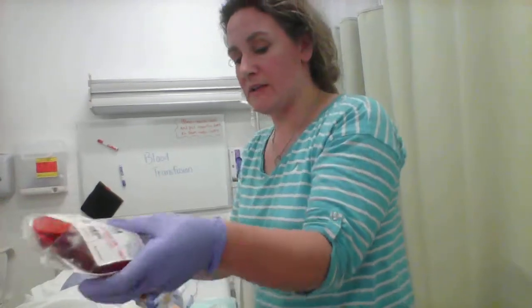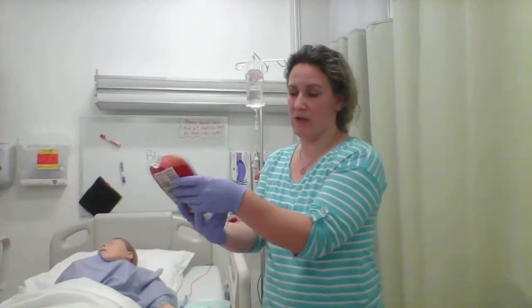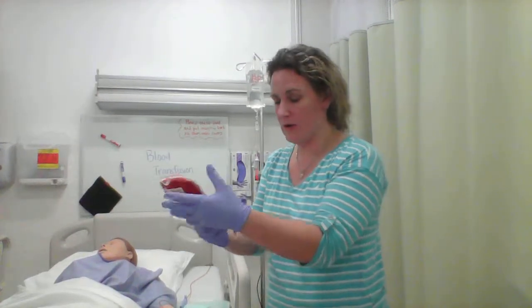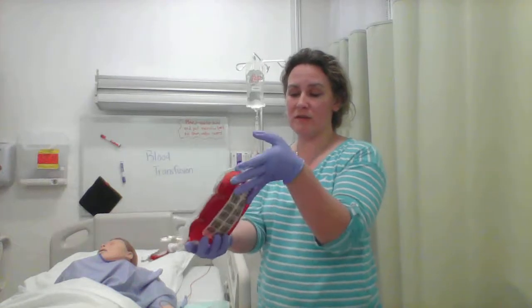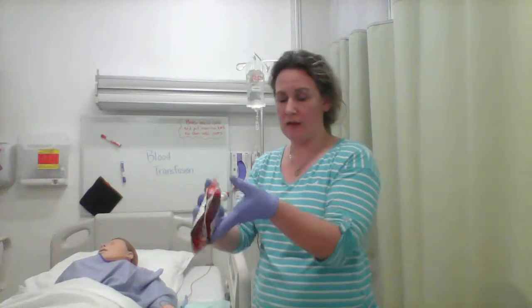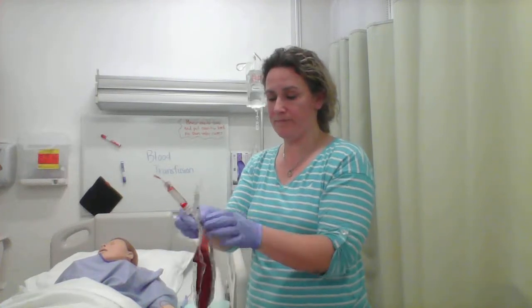So now we're going to inspect the package one more time, make sure everything's intact. We've already done all the checking, confirming that we need. So we're going to slowly move this 2 to 3 times to make sure that the red blood cells are evenly distributed and haven't settled to the bottom.